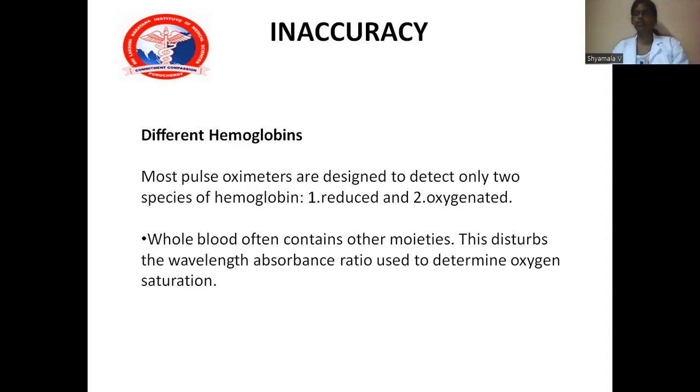Beer's law states that whenever the light is passed through the substance with a dissolved solute in it, the intensity of transmitted light decreases as the concentration of the substance increases. Lambert's law states that whenever the light falls on the homogeneous substance, the intensity of transmitted light decreases as the length of the light path increases.